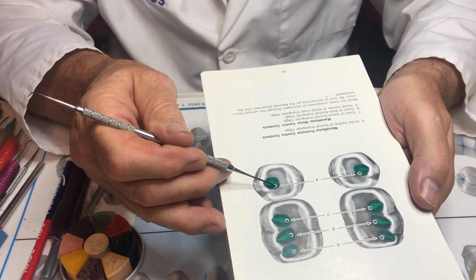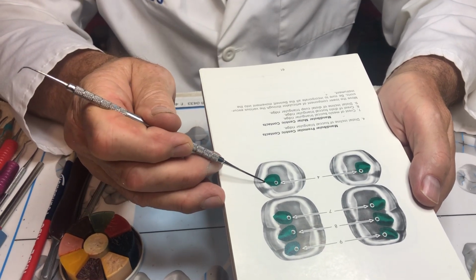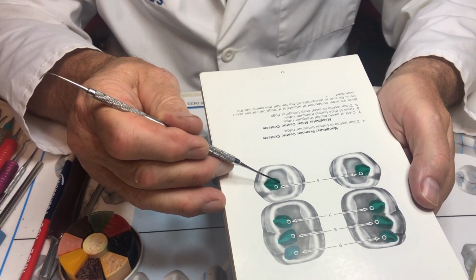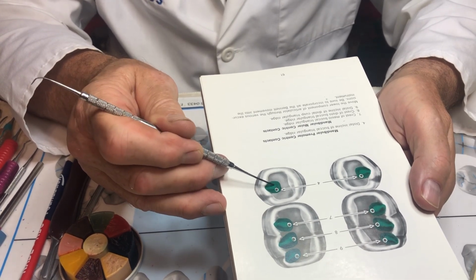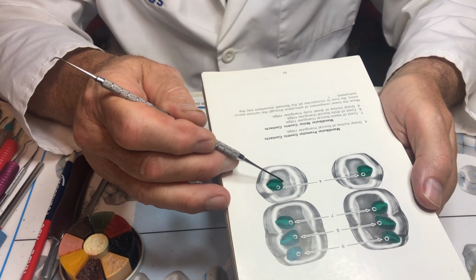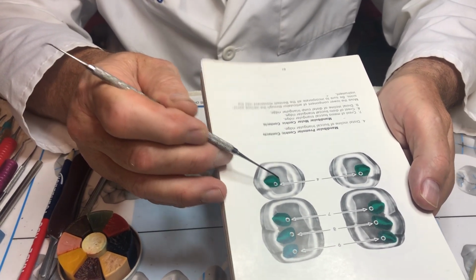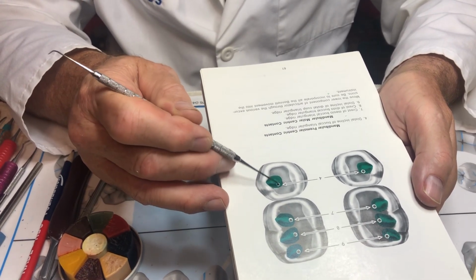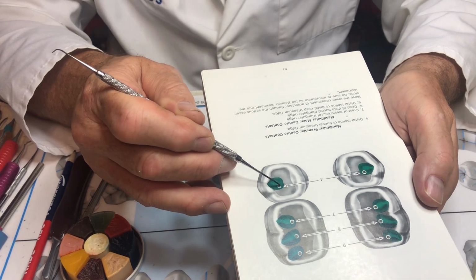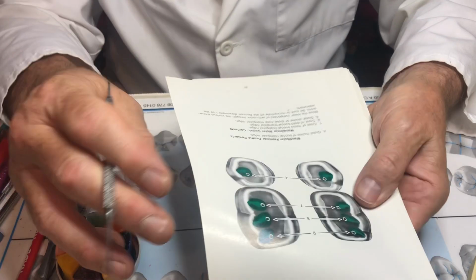If you look at where the contact points are, if I accidentally did this upside down, and instead of my point being here, my point was down there, I would never reach these. I would actually, the contact would be off to the side. So when I do the wax up, I always add, it's like a teardrop. I always start in the center. So the first drop I add, I do not add like this, I add this way, mesial distal. So then as soon as I have the contact, I know I've established it, then I can finish this. So let's move on to the next page before we start.